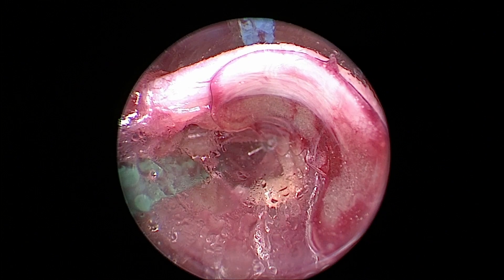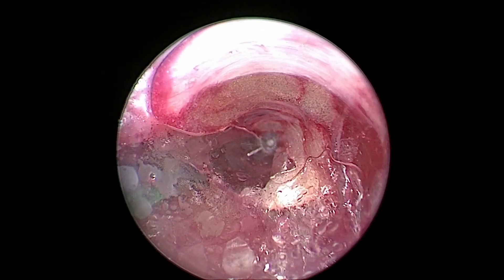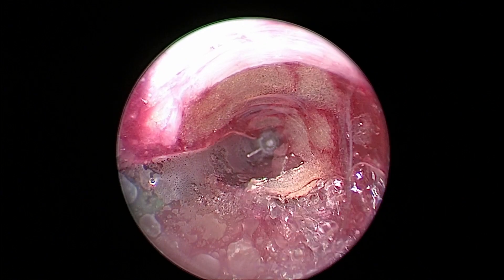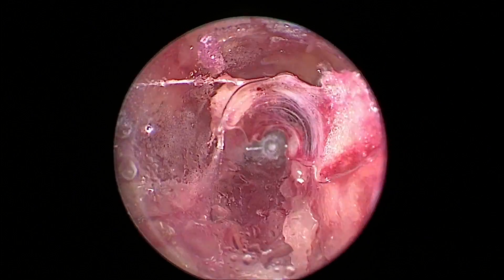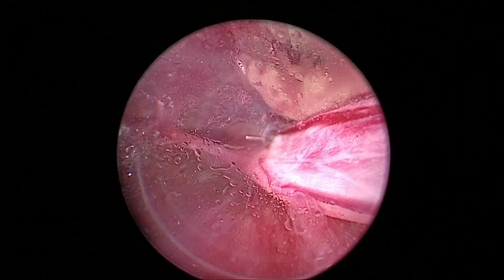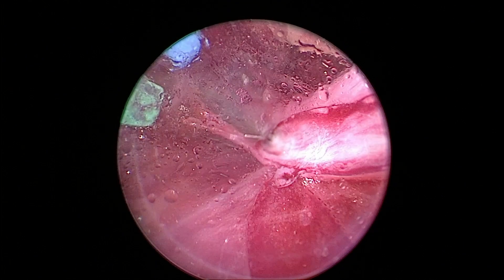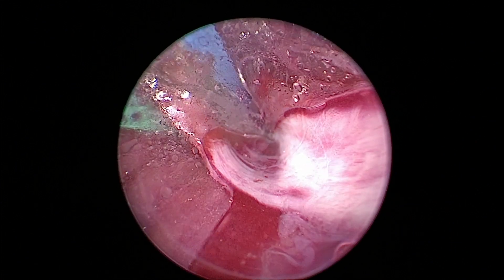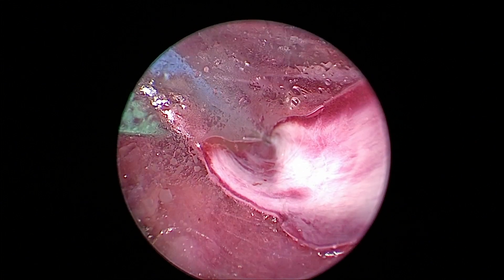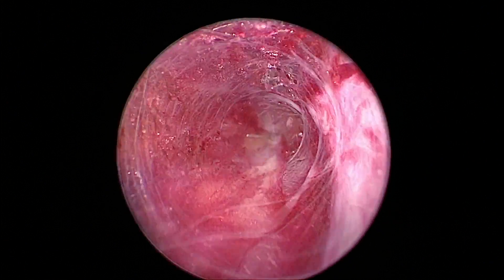I like this technique because the branch stays in view the whole time. It's just a collection of clips using the pullback technique on large branches and medium-sized branches. You can see one right there — I'm just going across the branch and cauterizing slowly a few times with the Pac-Man technique. I advance towards the crux and then just pull the slider back quickly.